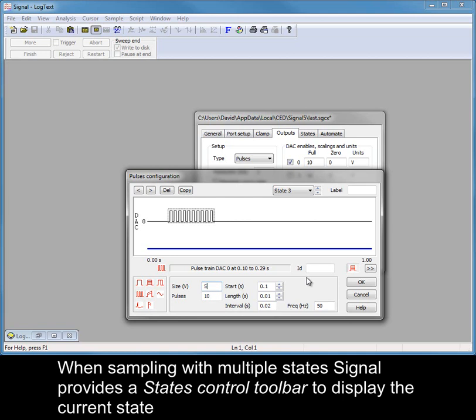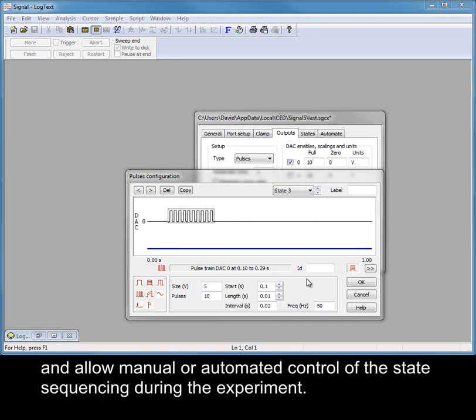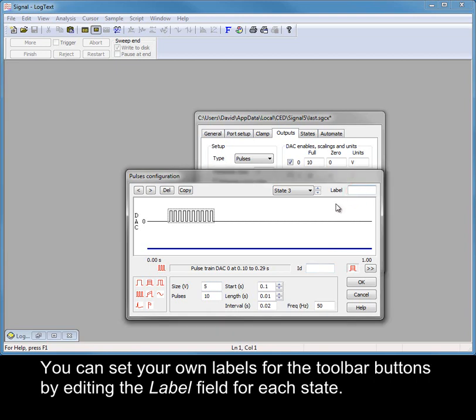When sampling with multiple states, Signal provides a states control toolbar to display the current state and allow manual or automated control of the state sequencing during the experiment. You can set your own labels for the toolbar buttons by editing the label field for each state.